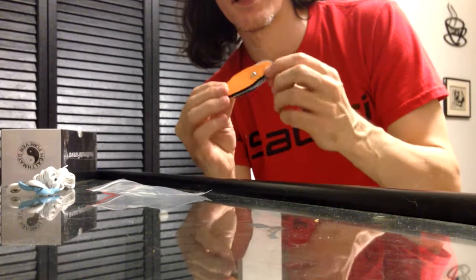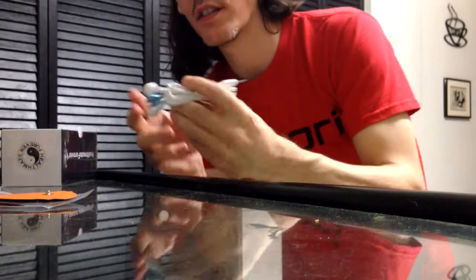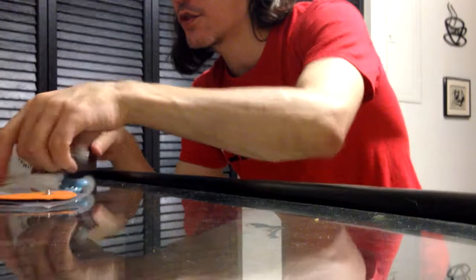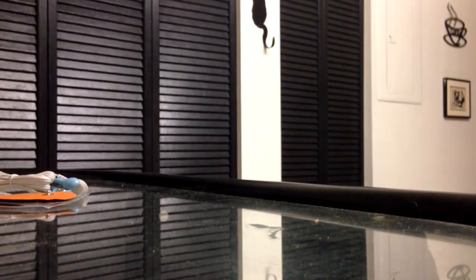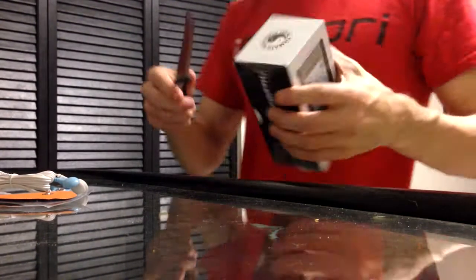Once you unstick these, that's it — they're unstuck. And this is indeed for four, so there should be more in the box hopefully. Hold on, let's open this up.